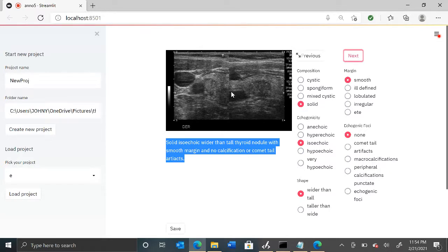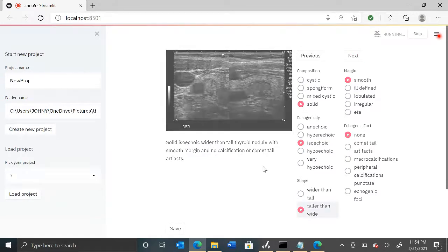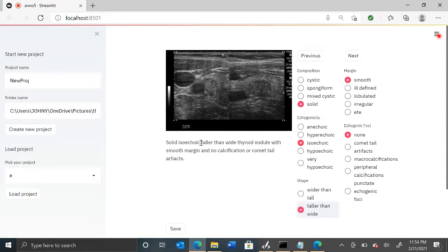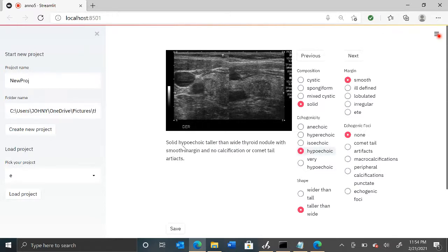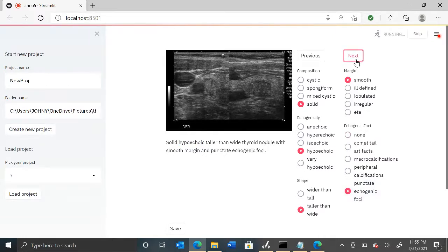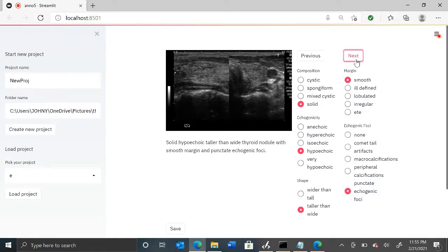Now this is a taller than wide nodule, so let's select that. As you can see this will automatically change to 'taller than wide nodule'. It is a solid nodule and it is hypoechoic, so let's change that — you will see that it changes here. It does have echogenic foci, so let's put punctate echogenic foci, and we hit 'Next'.